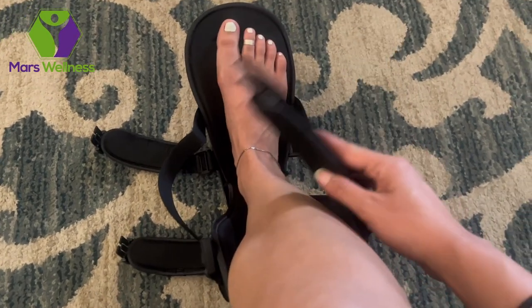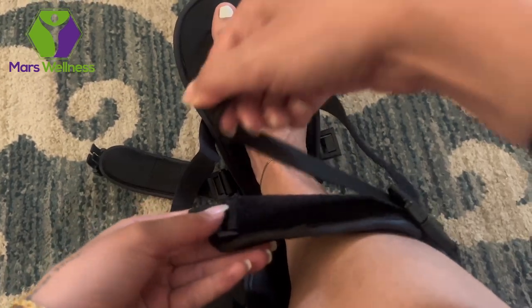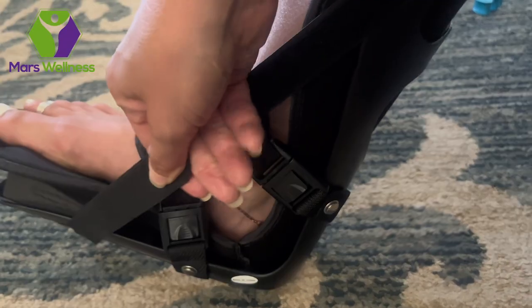Here's a bird's eye view of adjusting the straps — just pull back from the velcro and adjust. Secure it tightly and snugly around your leg. The tighter the velcro straps, the tighter the stretch will be. Just remember to keep your leg elevated.